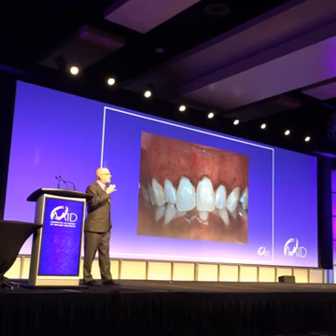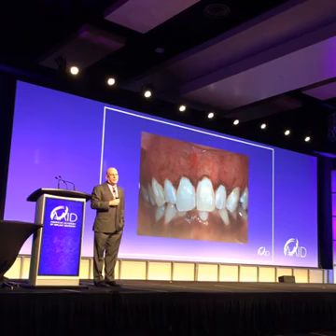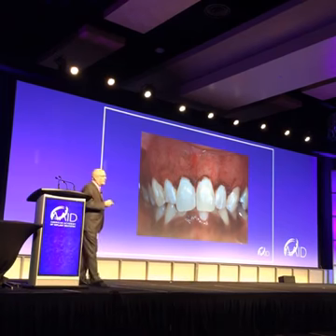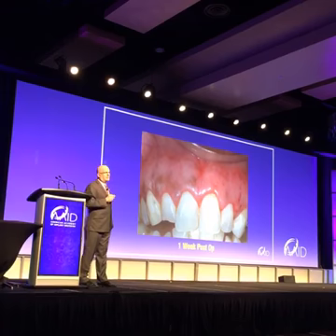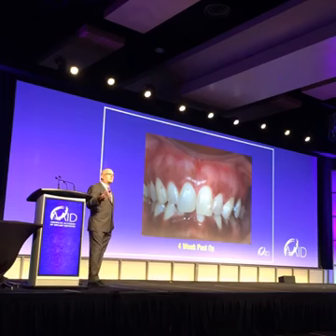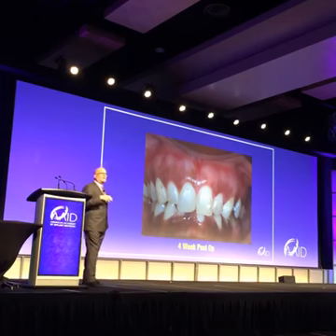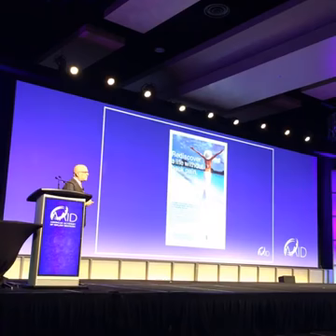This is what's happening inside a periodontal pocket when we treat with the LAPIP procedure, removing diseased tissue, leaving behind healthy connective tissue. This is what she looked like a week later. And this is what she looked like 4 weeks later. Very nice, we got a little bit of the melanin coming back, but not to the same extent. I think this is a lot more aesthetic than having bright pink gums. And she was very happy, had very little discomfort.